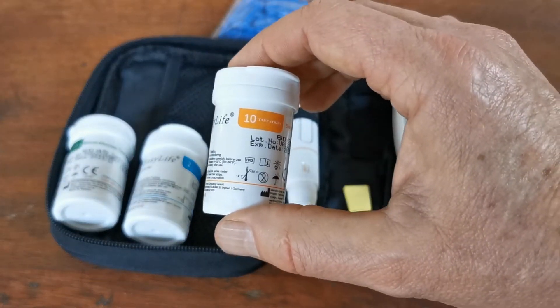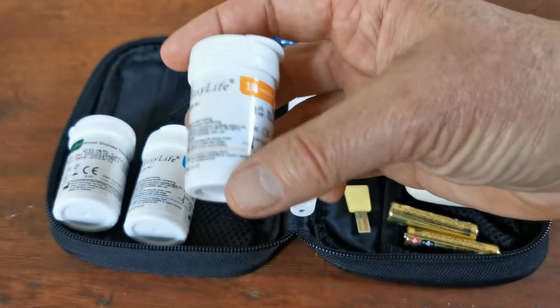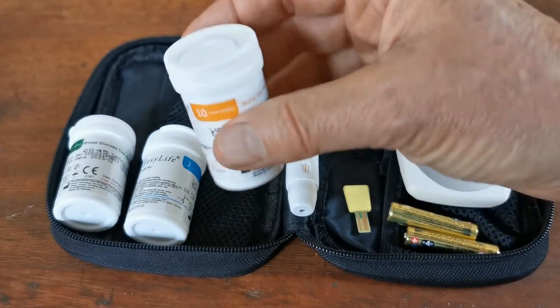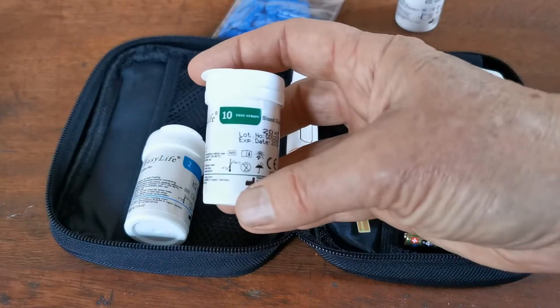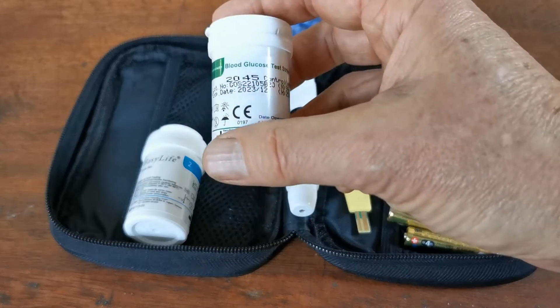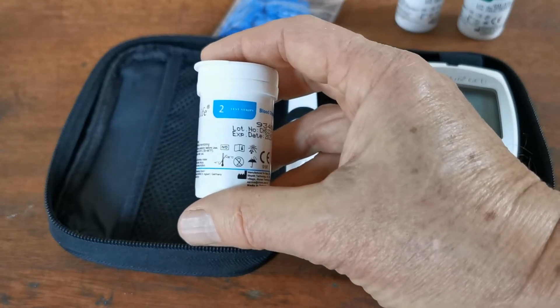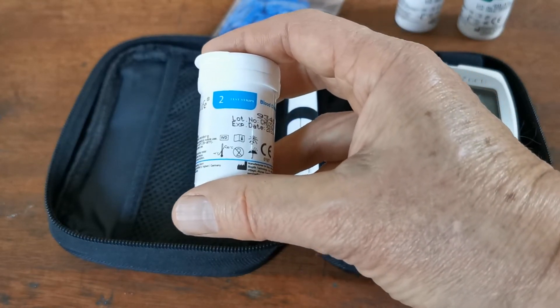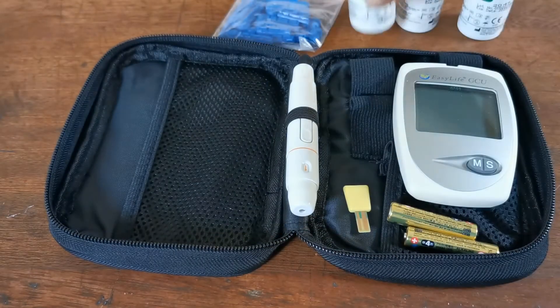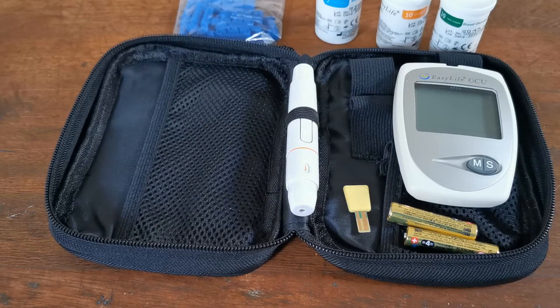If you're interested in testing for uric acid in blood, you get 10 starter test strips and a code chip included in the starter vial. Same again for blood sugar or glucose — 10 EasyLife glucose test strips and a code chip. For the cholesterol, I'm afraid you only get two test strips in the starter pack, but again with a code chip. That is the contents fully explained in the GCU starter. In the next stage we'll show you how to set the meter up, and in the final step how to do your first test.